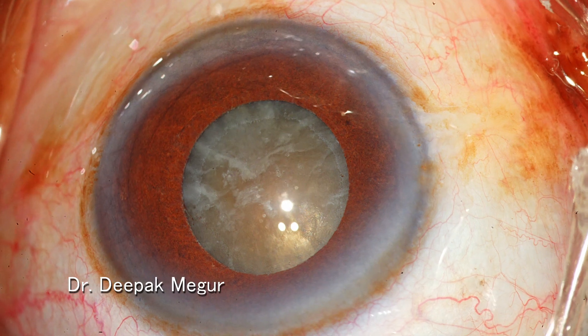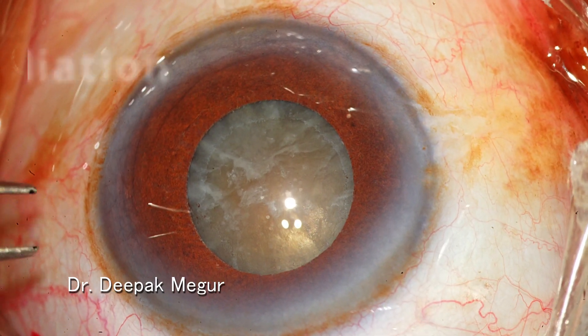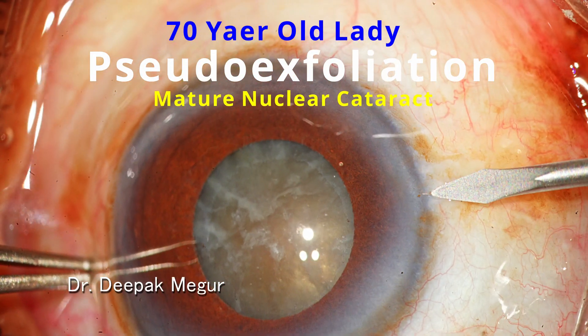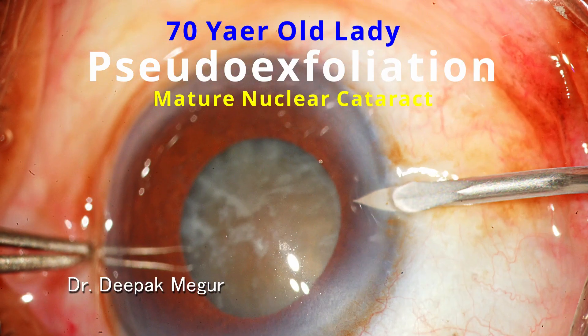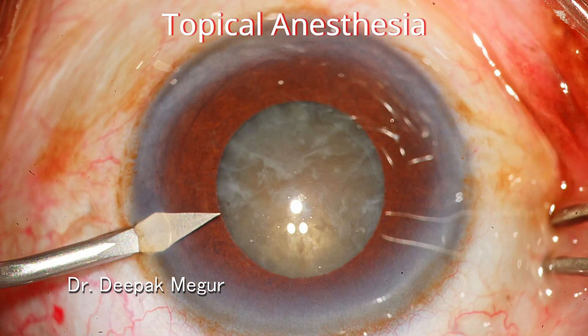I have chosen this case which has a slightly smaller pupil, which will help me to demonstrate the answer in a better way. Here we have an elderly lady with a hard brunescent cataract with pseudo exfoliation, and this is the maximum pupillary dilatation which could be achieved.